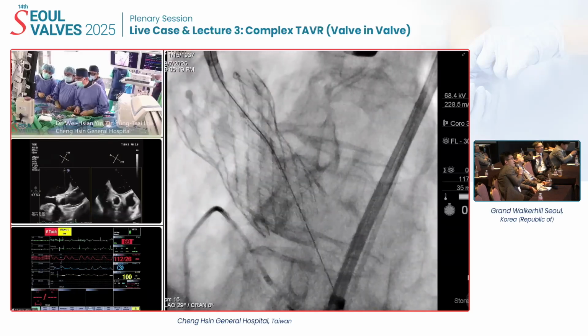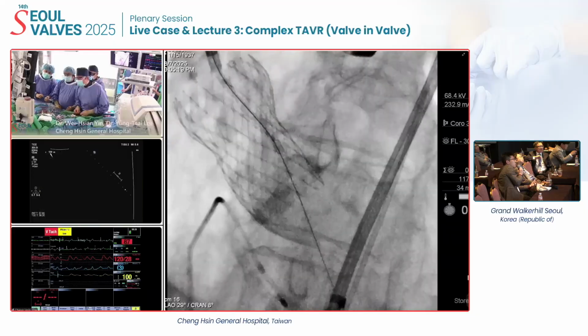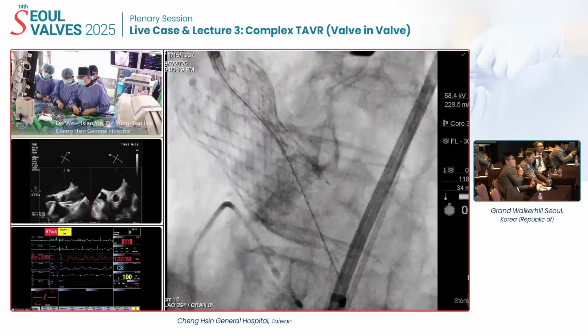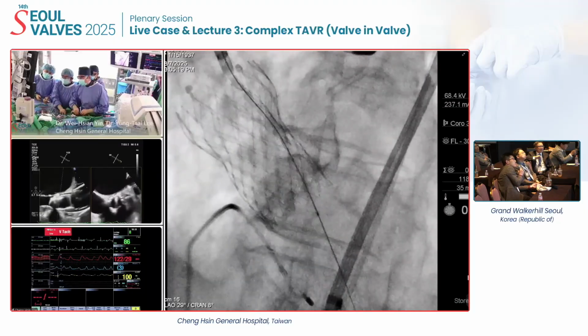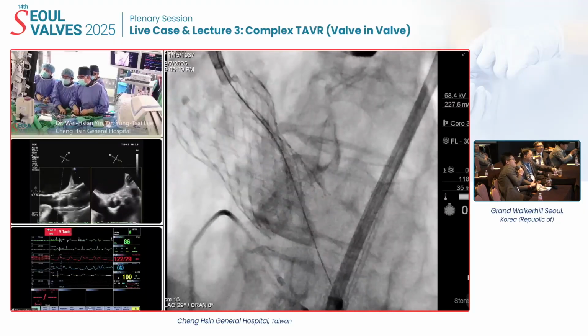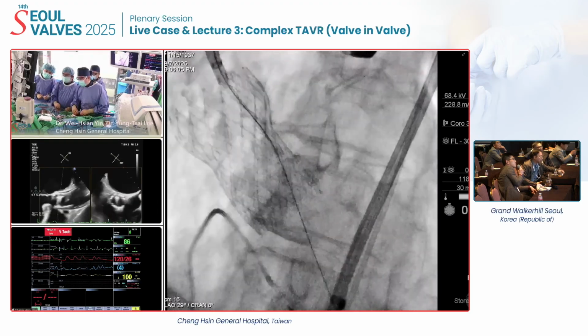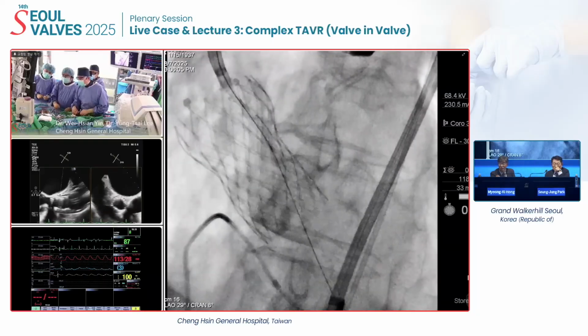Yeah. And now the most important part for the imaging is to really show the whole LV cavity, making sure the wire does not entangle into any parts of the mitral valve apparatus and so on. So I think they're probably mostly now focusing on the balloon dilatation of the fenestration. Now they are doing the balloon dilation. Yes.